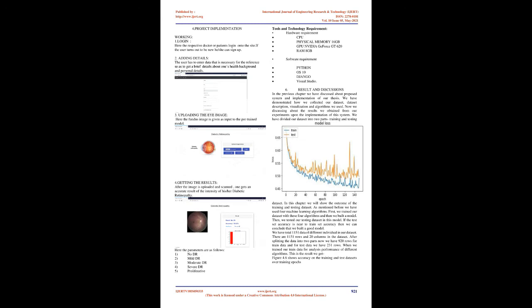The CNN follows a hierarchical model which works on building a network, like a funnel, and finally gives out a fully connected layer where all the neurons are connected to each other and the output is processed. Only image data is being trained for the CNN model. Processed images with a single band have been given as input to the network. The CNN model considered is the VGGNet model. The VGGNet model is structured of CONV layers which perform 3x3 convolution with stride 1 and pad 1, and pool layers which perform 2x2 max pooling with stride 2. There is no padding existing in the network.